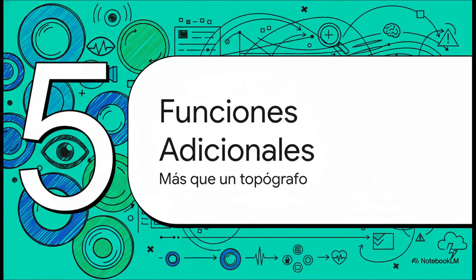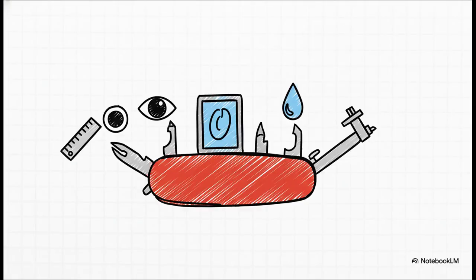You know, modern topographers aren't just single-purpose devices anymore. Let's quickly explore how these instruments have evolved into multi-diagnostic platforms with a range of powerful clinical applications. Today, many topographers can also accurately measure the horizontal visible iris diameter, perform pupillometry in various lighting conditions, simulate contact lens fits, analyze the tear film for dry eye, and even provide corneal thickness measurements, or pachymetry. They've really become the Swiss Army knives of the optometry clinic.